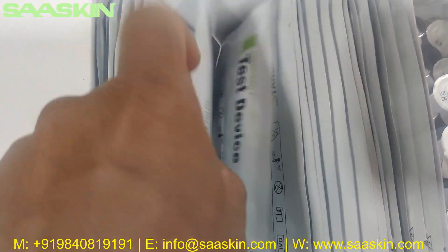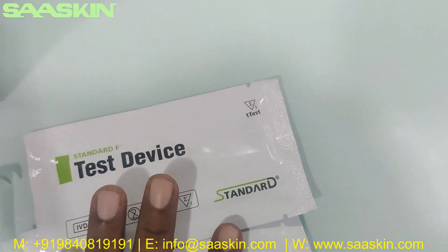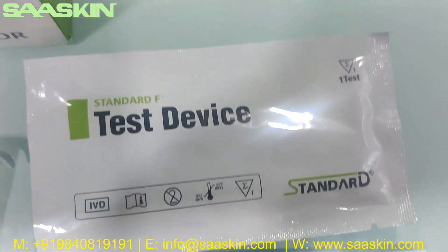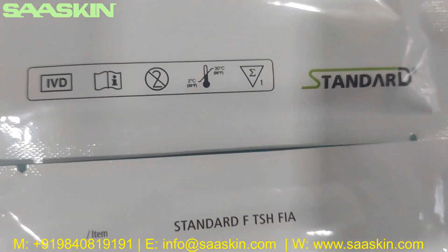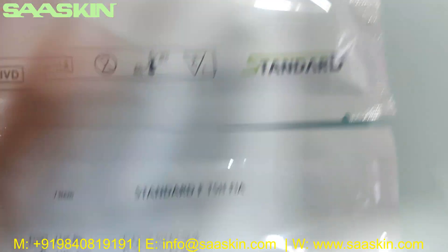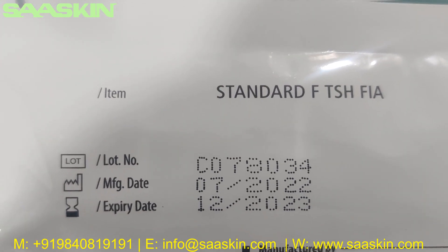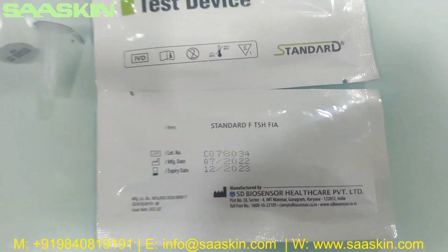There are also 20 test cartridges. Let me take one out — this is the test device. You can see the STANDARD-F test device; it is IVD certified and stored at room temperature. It has the lot number, manufacturing date, and expiry period.